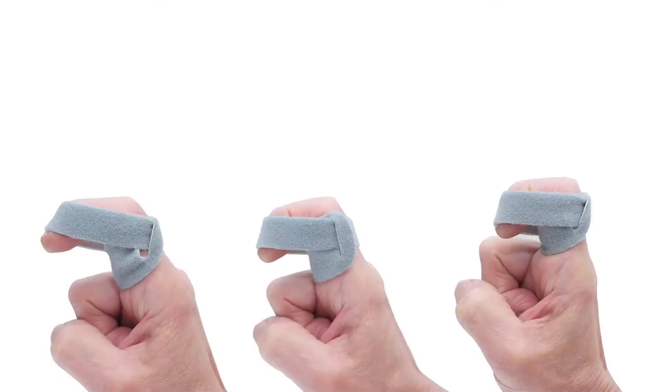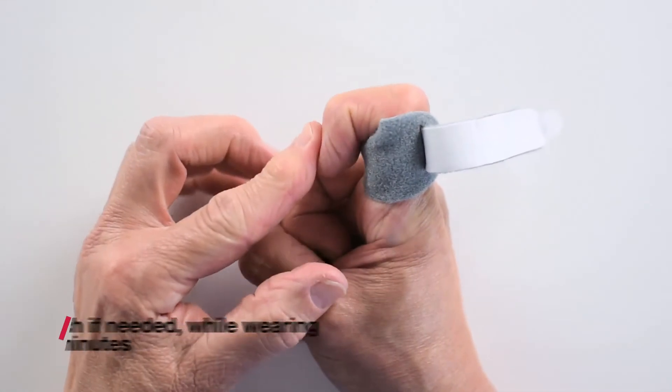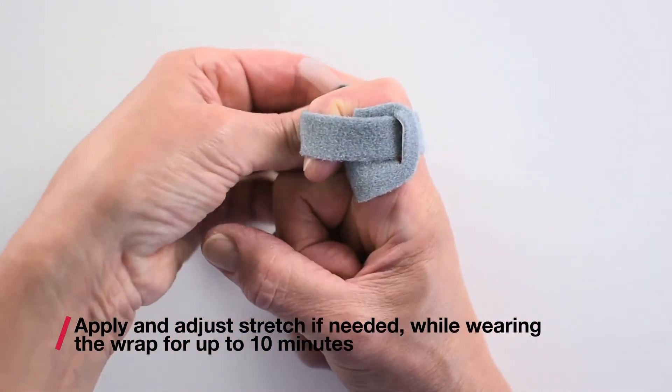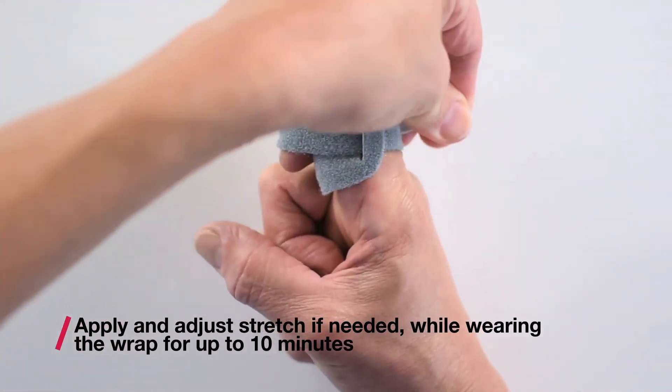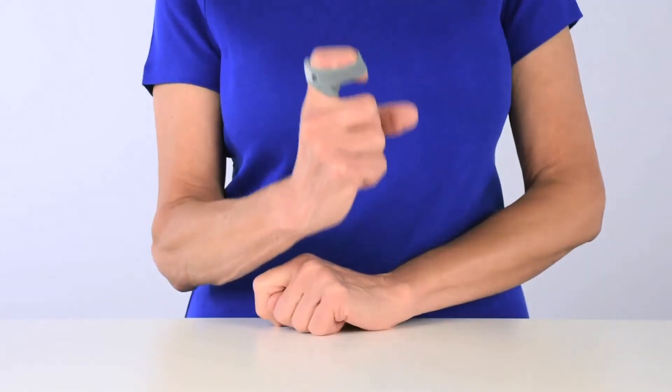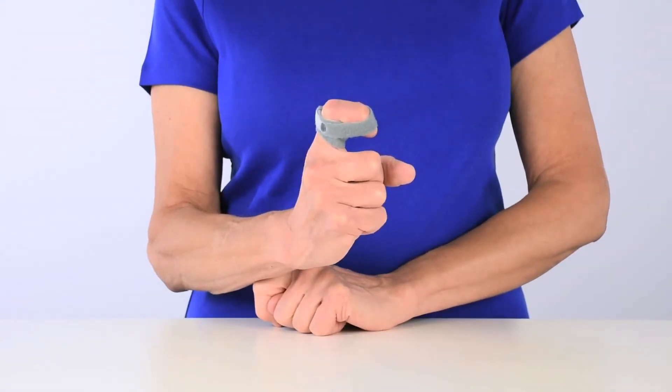Gradually apply more stretch as tolerated to help the finger bend. Continue stretching the finger and wearing the strap until you have achieved the maximum amount of bending your condition will allow. To gain maximum motion, be sure to gradually adjust the stretch over short wearing periods.